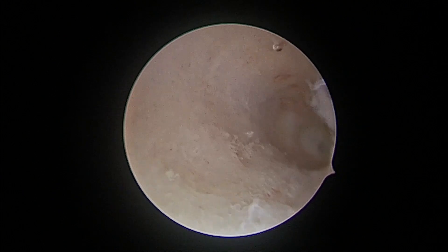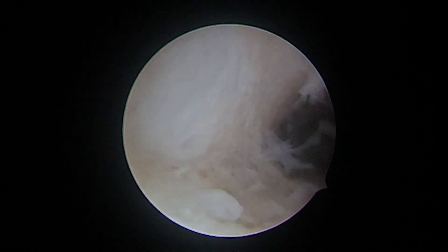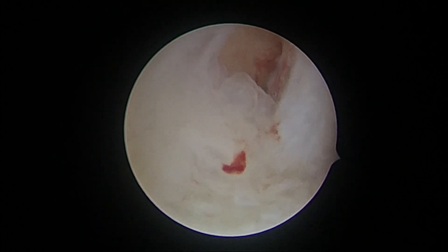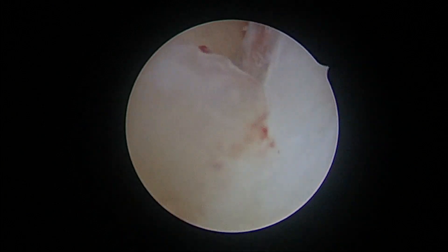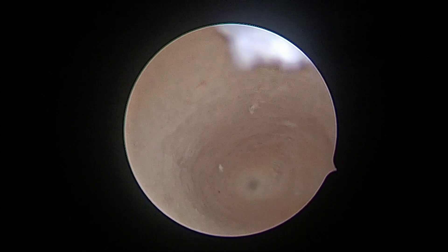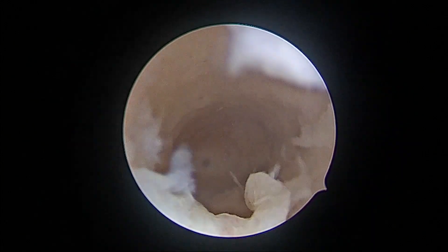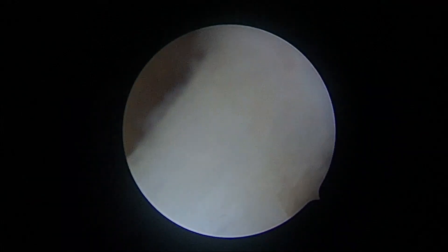Then we again follow the septum right up to the tip and negotiate the telescope on the right side. Here again you can see the uterine space on the right side of the septum right up to the tubal ostium.